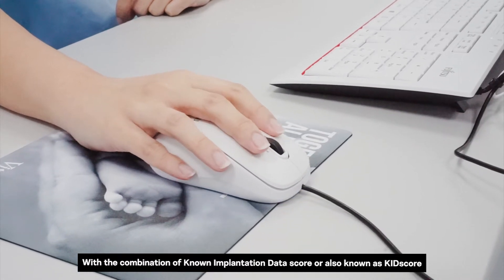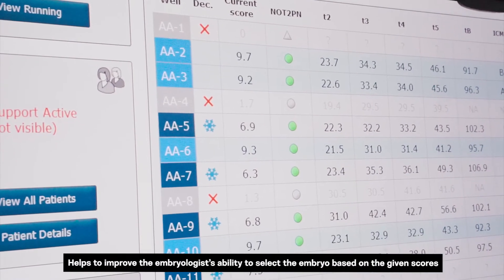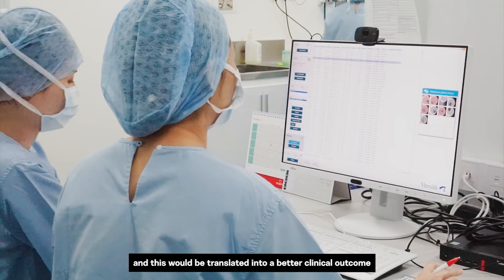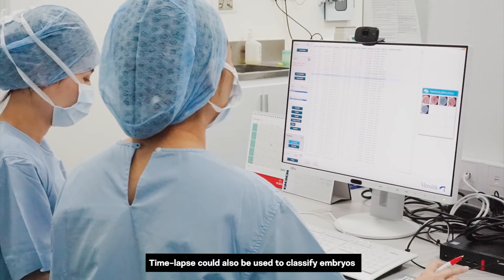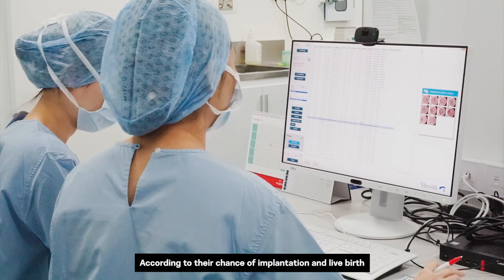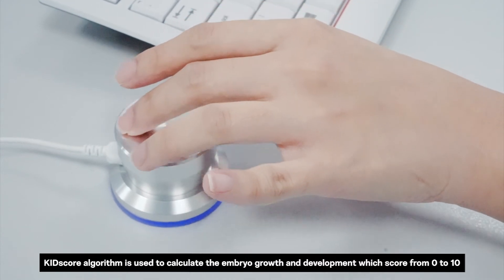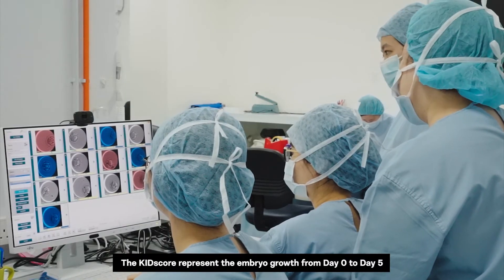The Known Implantation Data score, also known as the KID score, helps to improve the embryologist's ability to select the embryo based on a given score, and this would be translated into a better clinical outcome. Time-lapse technology can also be used to classify embryos according to their chance of implantation and live birth. The KID score algorithm calculates embryo growth and development with a score from 0 to 10, representing embryo growth from day 0 to day 5.